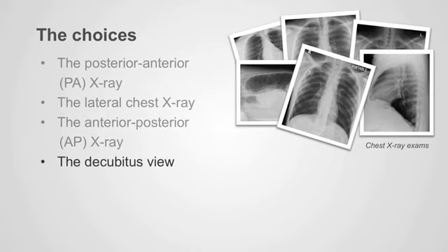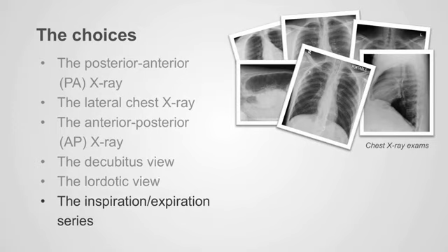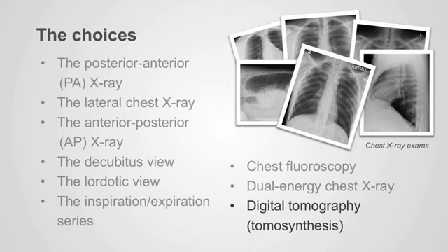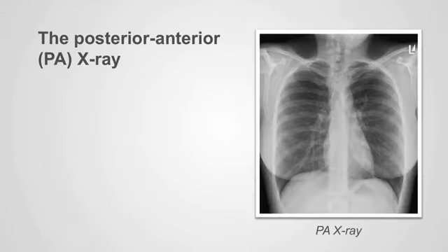X-ray, the decubitus view, the lordotic view, the inspiration-expiration series, chest fluoroscopy, dual energy chest X-ray, digital tomography or tomosynthesis. The preferred examination is the posterior-anterior X-ray.